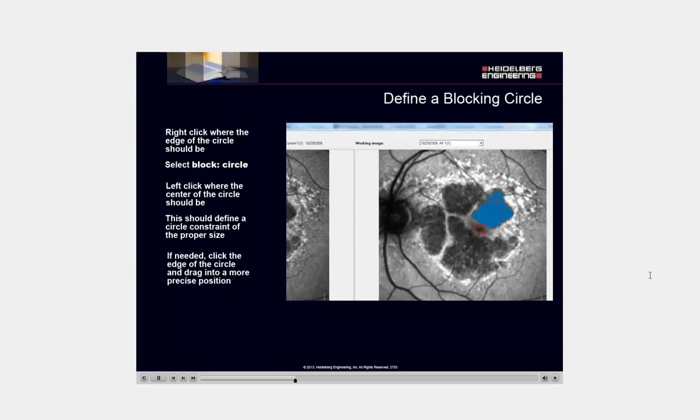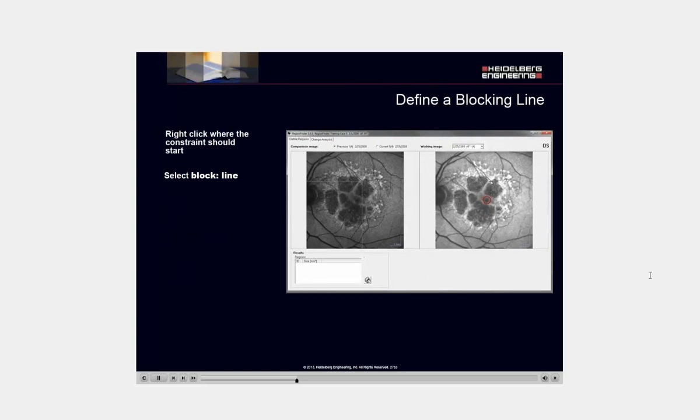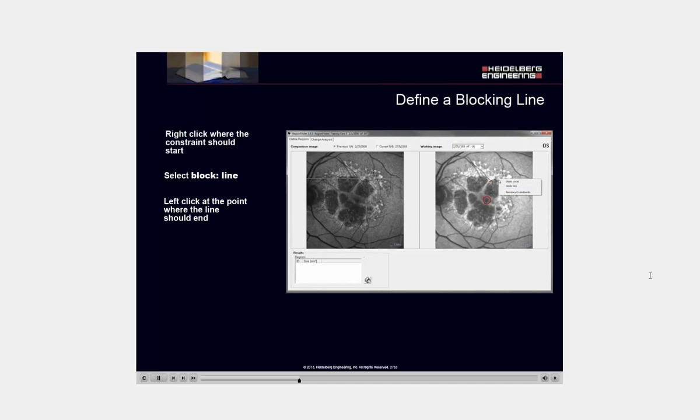Right-click where the constraint should start. Select Block Line. Left-click at the point where the line should end. If needed, click and drag the line into a more precise position.